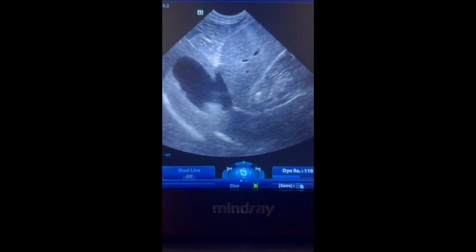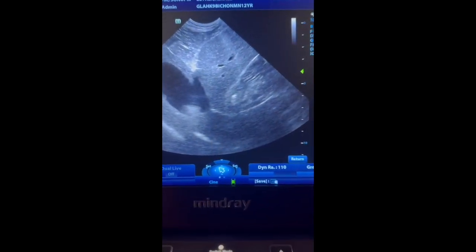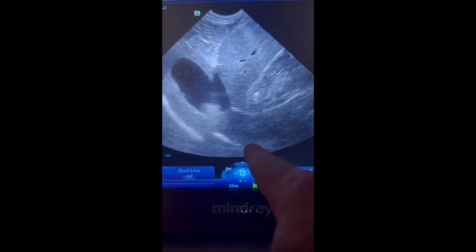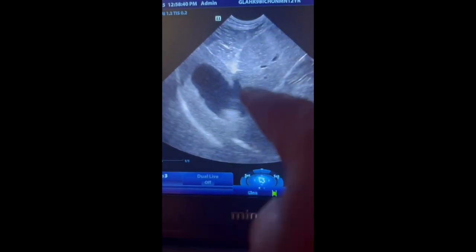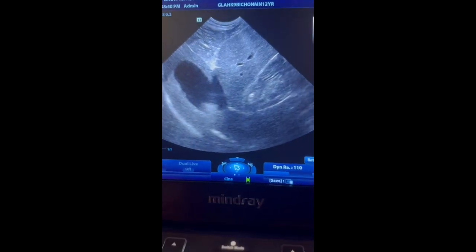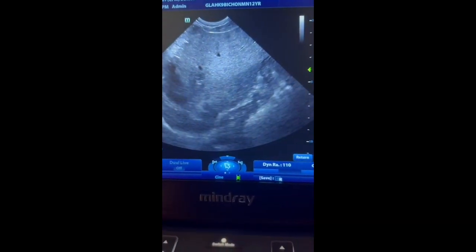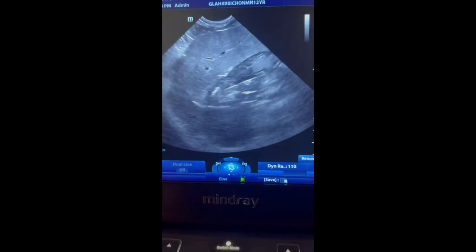So this is a Bichon live and just still images, but you can see we have 10 centimeters resolution depth here on an older Bichon. So an easier scan, more harmonic from a physics standpoint. The dog was not tense, but you can see solid 10 centimeters.